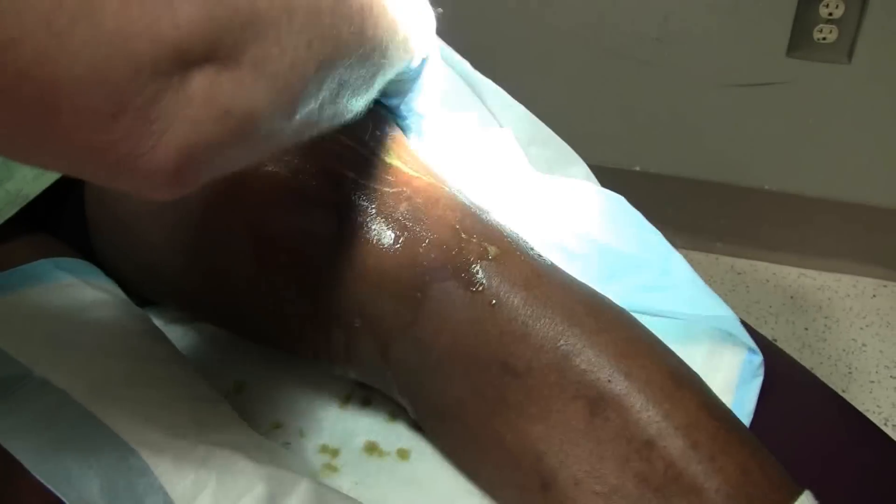Today we're going to do a knee joint aspiration. This gentleman has a history of gout — not real severe — but has had this leg swelling going on for four or five days. He doesn't know of any specific injury. Compare the two knees — this one is massively swollen. He didn't trip, fall, or injure it, and he's not running any fevers or chills.